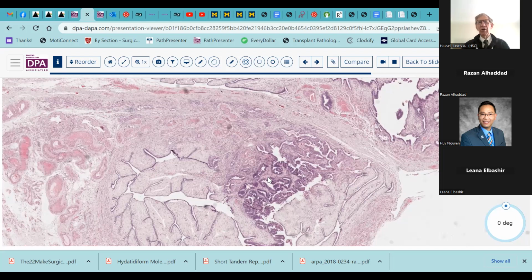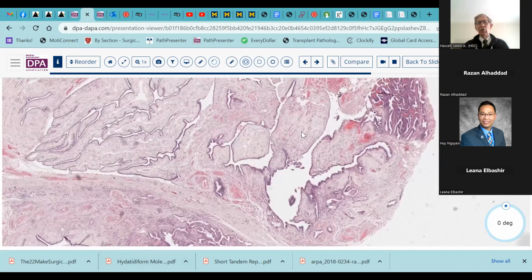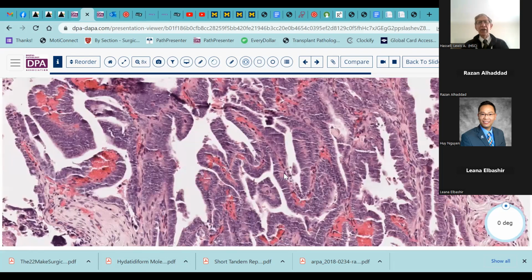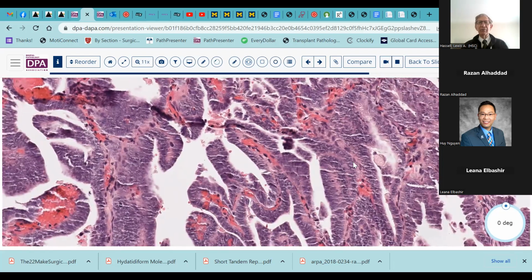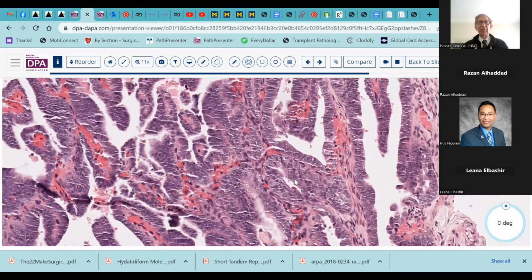It is not prone towards vascular invasion or lymphatic spread at an early stage, but it does very readily spread intraperitoneally. And so it's conceivable that even very small lesions like this, or like this one over here, could be the primary nidus of expression of this tumor that, with ready access to the peritoneal cavity, is allowed to spread far and wide within that space as a neoplasm.